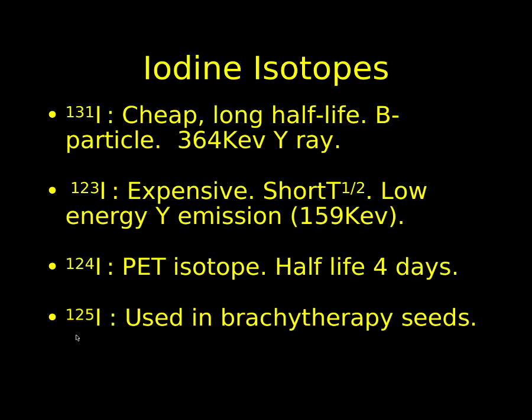If we want to do a renal scan, we need to link technetium, the isotope, with MAG3 to take it to the kidney. But fortunately, the thyroid gland will naturally concentrate iodine, and therefore it will, without any pharmaceutical, take up the various iodine isotopes. Now there are 37 iodine isotopes in nature, but only 4 of them are used in medical practice. The one which is historically used most frequently is iodine 131. That's relatively cheap and is produced in nuclear reactors as a fission byproduct. It's the isotope of concern in nuclear accidents.